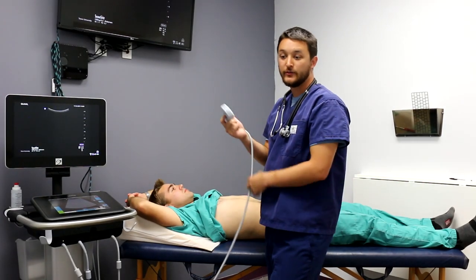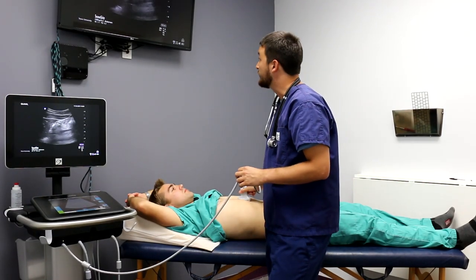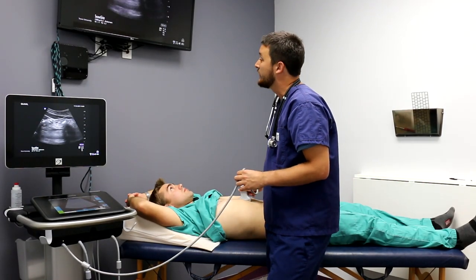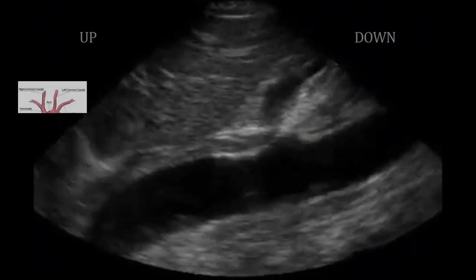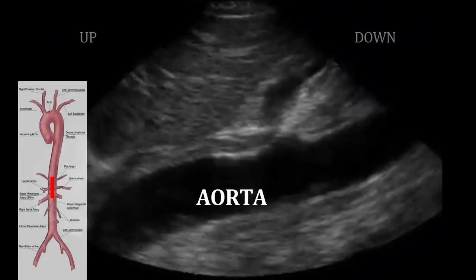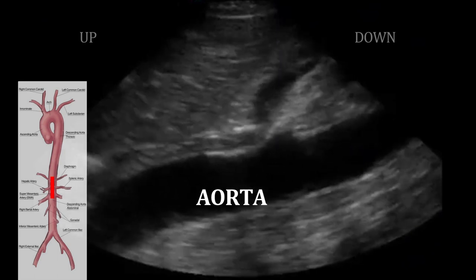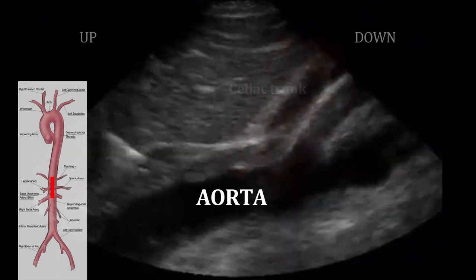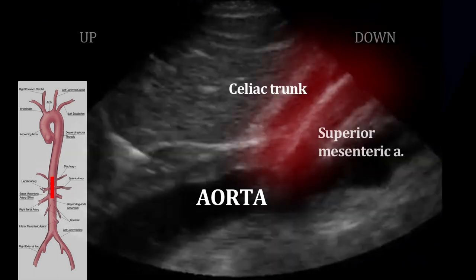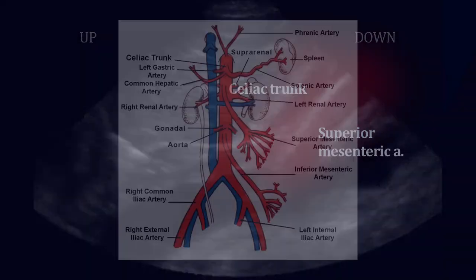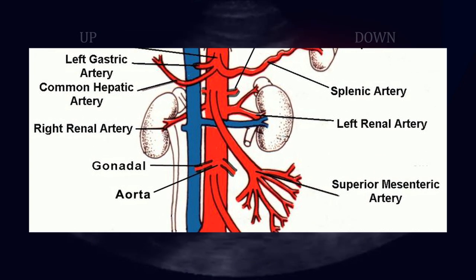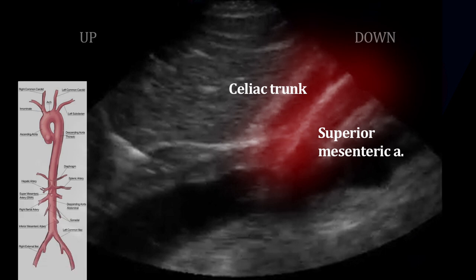Once we've completed the short axis view, we want to make sure we get a long axis view as well. It's a very similar approach — we begin at the epigastrium and move inferiorly down to where the aorta splits. The long axis view allows us to visualize the celiac trunk and superior mesenteric artery. The SMA is very close to the renal vasculature, with the left renal vein actually passing just behind it. This is an important landmark because most AAAs are actually infrarenal, or below the renal arteries.